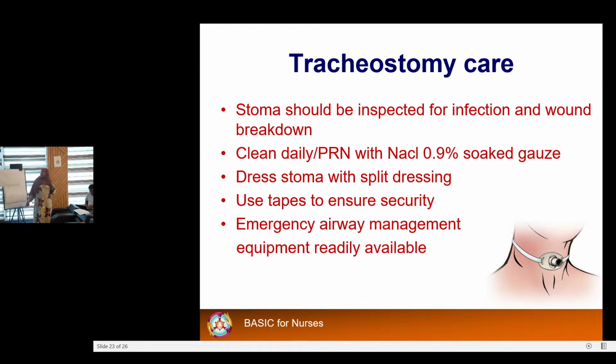Tracheostomy care. Whenever you do tracheostomy care, airway management equipment should be there, because sometimes zina block hizi. Dr. Ismail atashare alishapata complication na mgonjwa wake, lakini kwa sababu alikuwa yuko well prepared akaweza kumsave mgonjwa. But if you are not prepared, I always tell you, if you extubate your patient, make sure intubation trolley with all drugs are there. That happens.